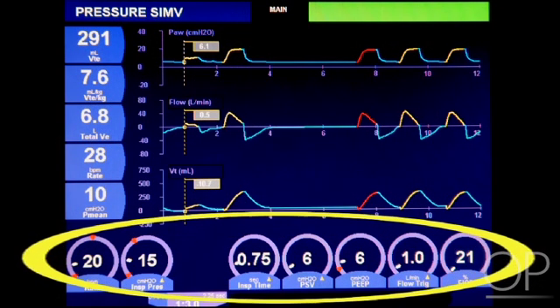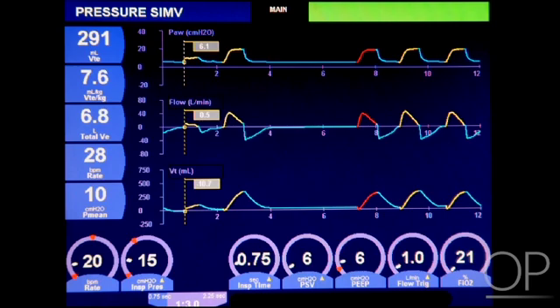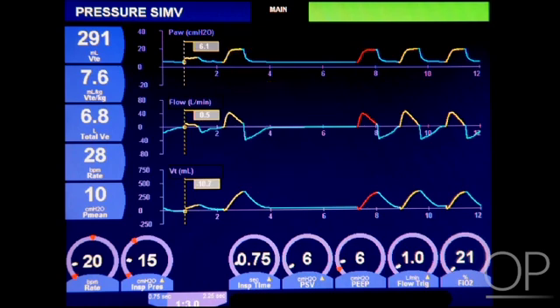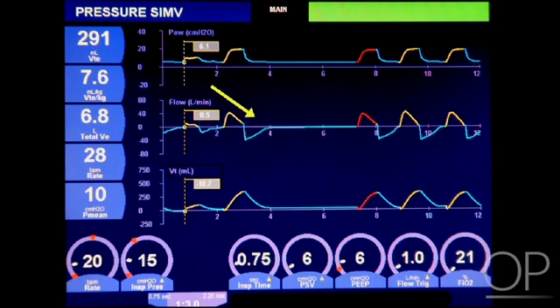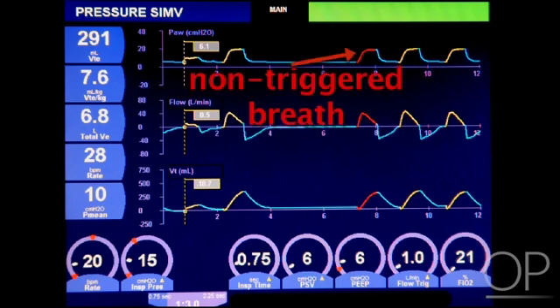Let's look at a screen of a typical ventilator. On the bottom you see the numbers set on this ventilator, and on the side are the numbers read off the ventilator. You typically have three curves: pressure on top, flow in the middle, and volume on the bottom. This patient is in pressure control. You can see the relatively square wave of the pressure waveform, and below it the flow waveform with a decelerating flow. Note that the flow decelerates to zero in both inspiration and expiration. Most ventilators have some way to delineate whether the breath is triggered by the patient or not — in this ventilator, the non-triggered breath is red and the triggered breath is yellow.